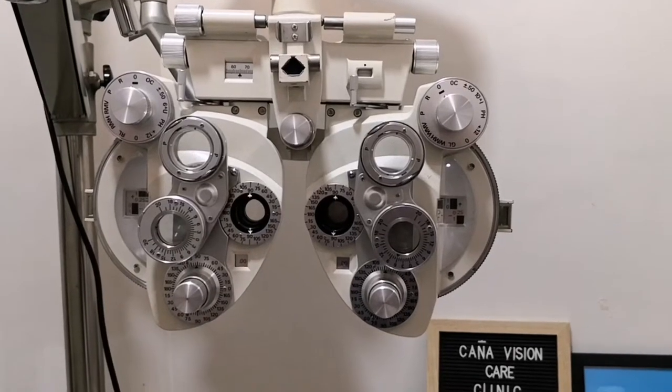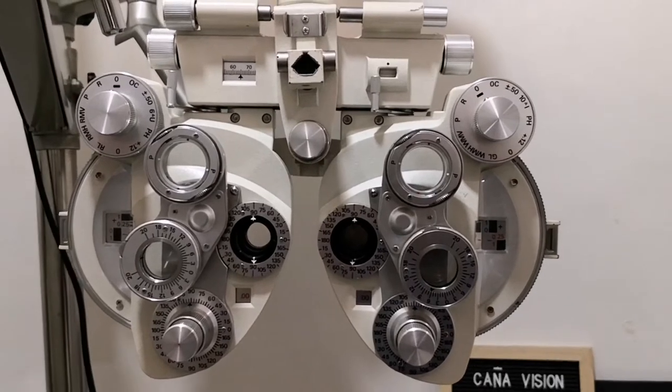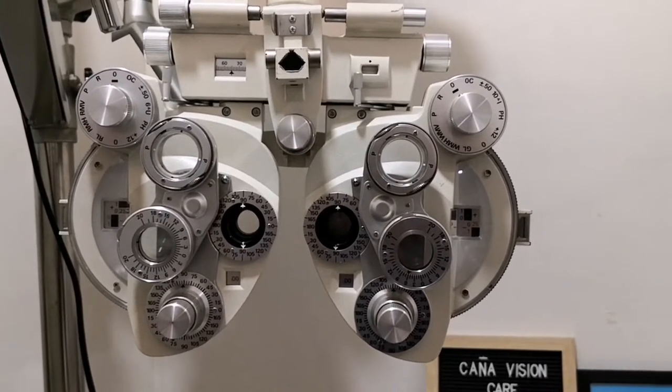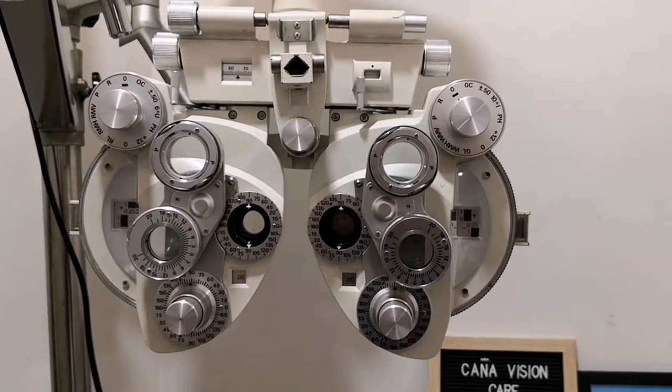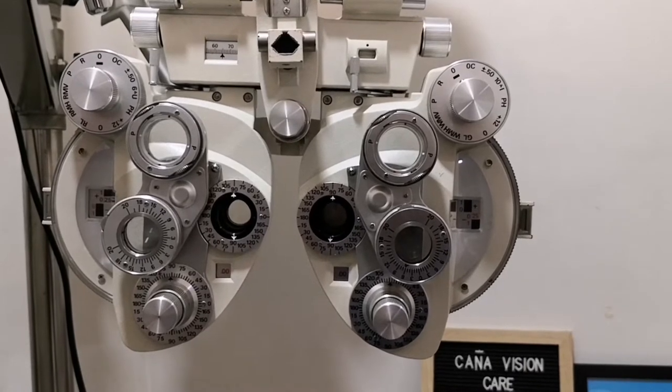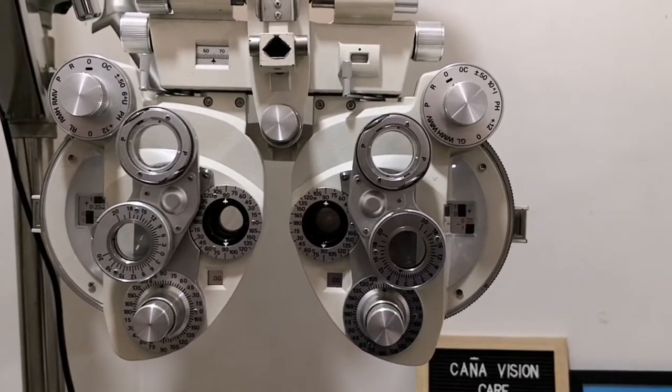The phoroptor is the main part for the refraction division of eye examination. The phoroptor is a complex lens holder designed to allow the examiner to change lenses efficiently and easily. It consists of four groups of control.